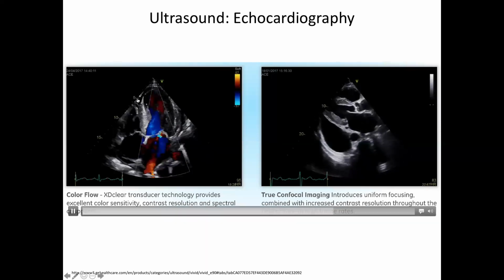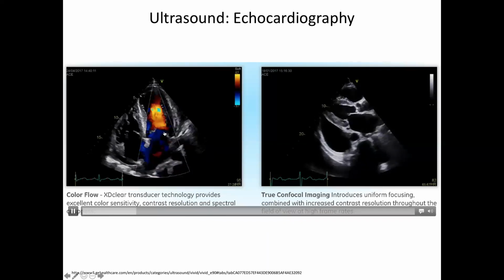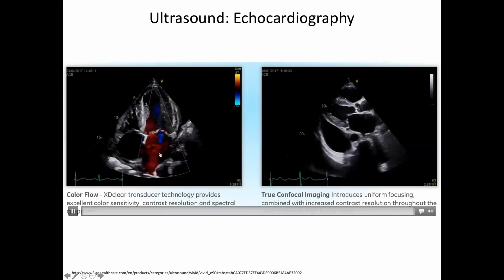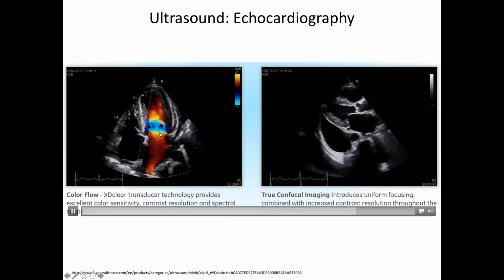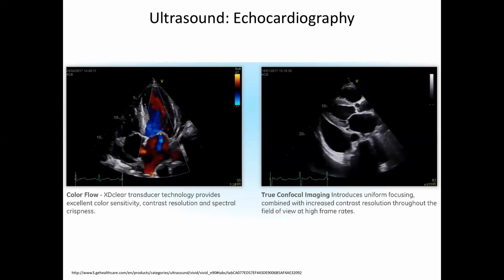And the interesting thing is you can see that this mitral valve, this structure right here is the mitral valve. And then when the ventricle is contracting, there is a blue jet right here. See that little that comes through? And that is blood that is moving away from the transducer. It shouldn't be moving away from the transducer, right? It should stop right here, right? But what's happened is this mitral valve is not coapting perfectly well. There's a little hole there. When it tries to close, for whatever reason, it's not closing, and there's a leak.